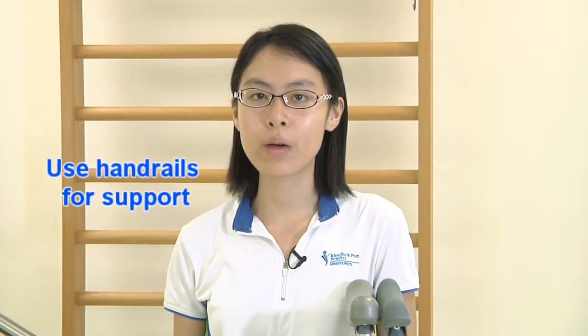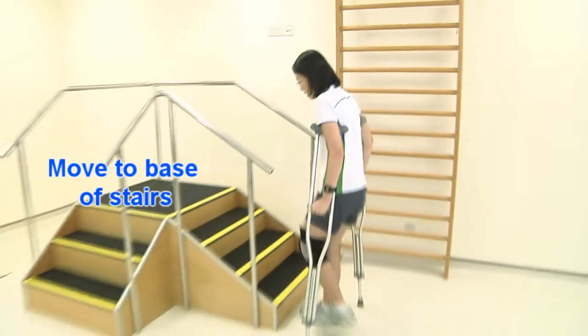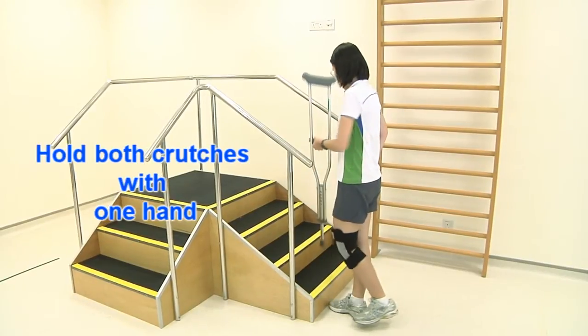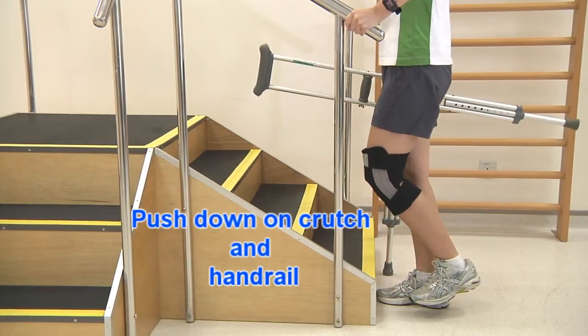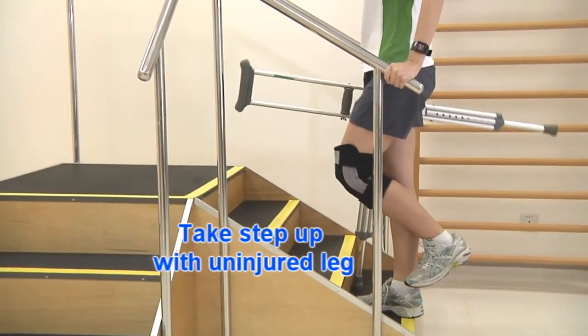In the presence of a handrail, you can use the handrail to help you up and down the stairs. First, move to the base of the stairs. Hold both crutches with one hand and place the other hand on the handrail. Push down on the crutch and the handrail and take a step up with your uninjured leg.